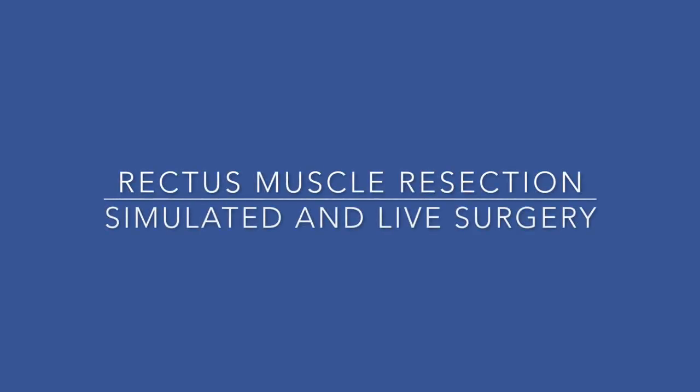In this video we'll illustrate how to carry out a lateral rectus resection, both on a simulated eye and also demonstrating some clips of live surgery.